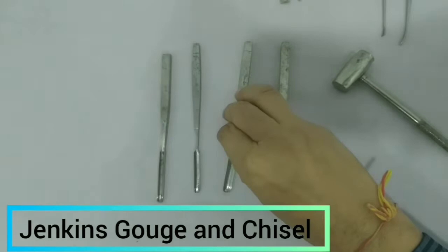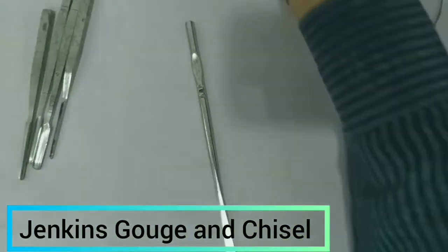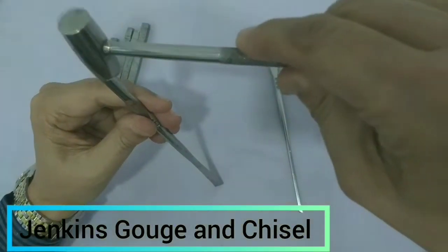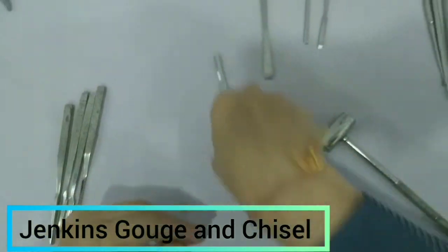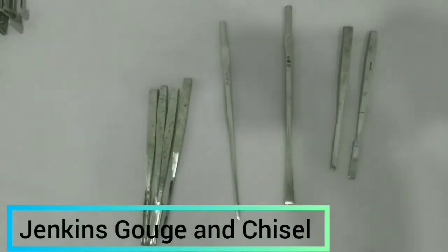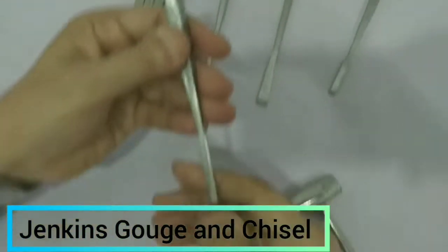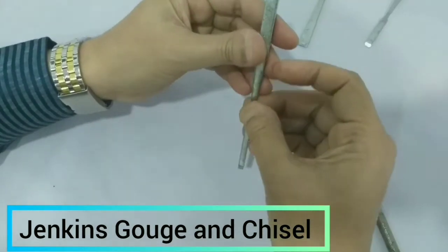You can see the different sizes — this is the largest size and this is the smallest size. These are the chisels — they also have a head, and the hammer will strike over this to help in removing the bone. There are four sizes of chisel. You can see the head is present in both the chisel and the gouge. In the gouge the tip is U-shaped with a groove, whereas in the chisel the tip is flat and beveled. Depending on the nature of the surgery and the amount of bone we want to remove, we can use these instruments accordingly.